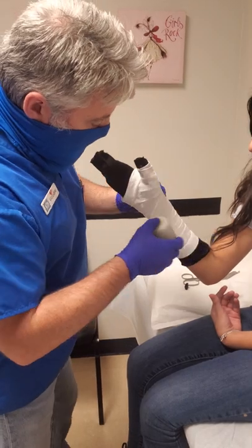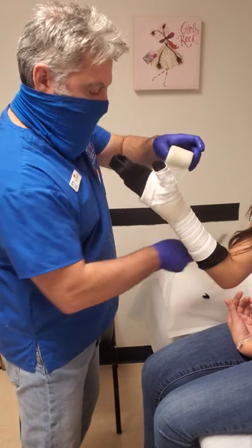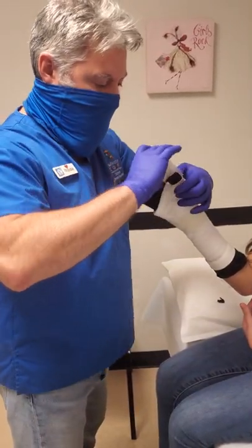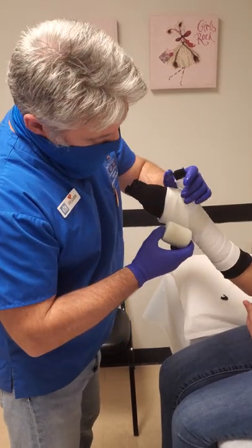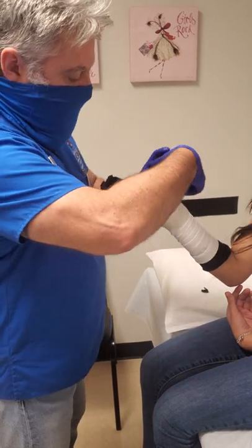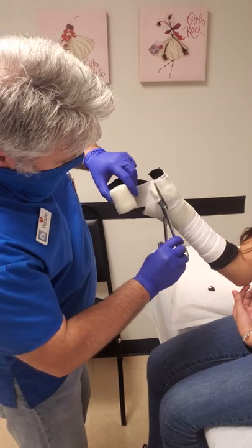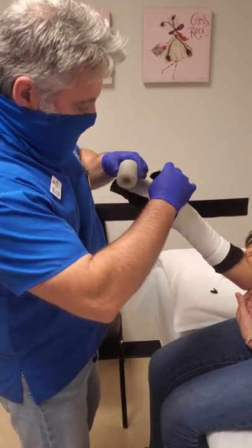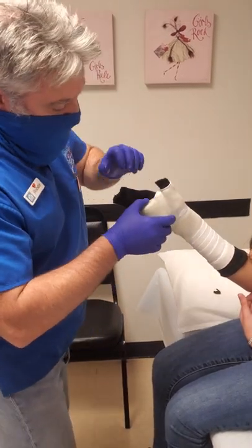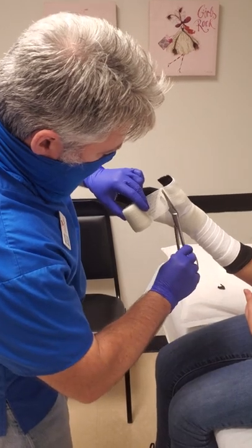Now we're going to start with the fiberglass. The underneath layer is the initial portion of the cast. You want to make that first cut in the same angle as the thumb. Unlike the short arm cast where we folded that in, we're going to leave the flaps out — because it's going to act like reinforcement on the base of the thumb. You're going to cut a line parallel to the thumb, and you're going to do that once or twice depending on the size of the patient and the size of the thumb. Of course, if it's a really small child, you only really need to do it one time.